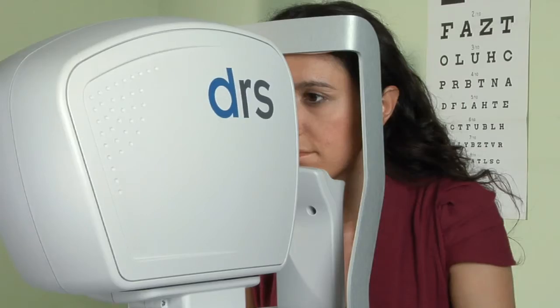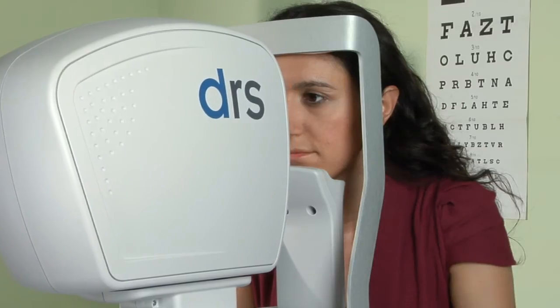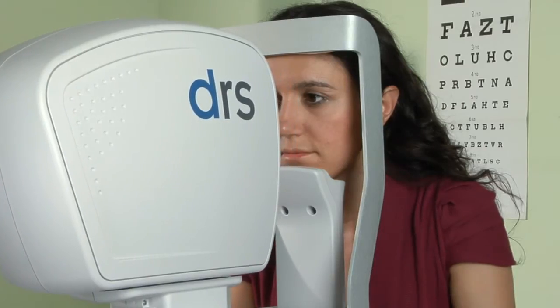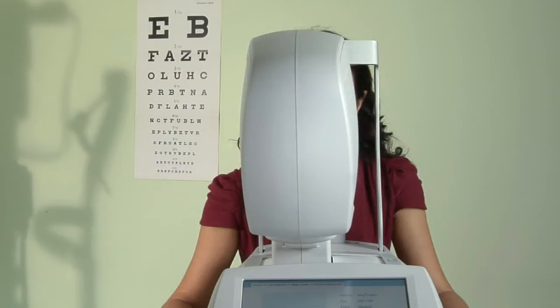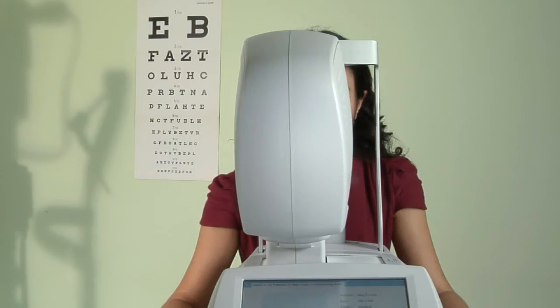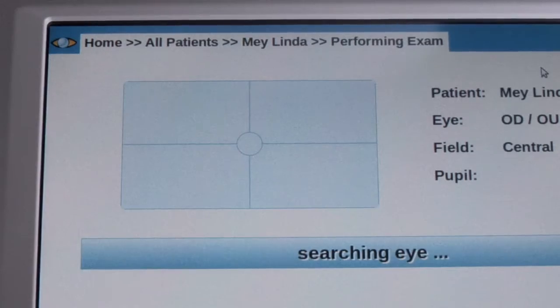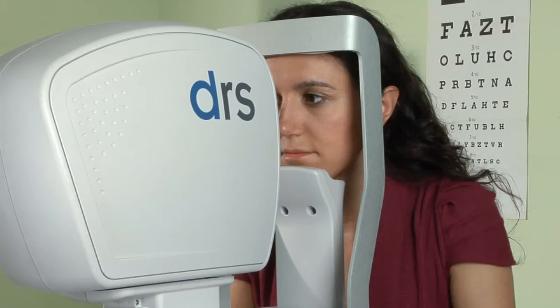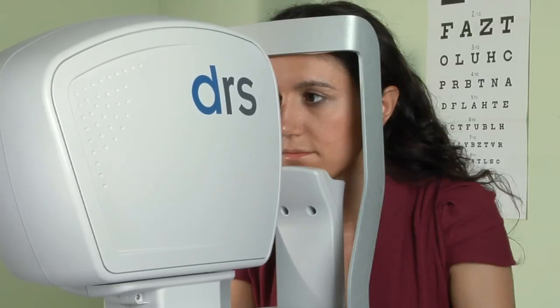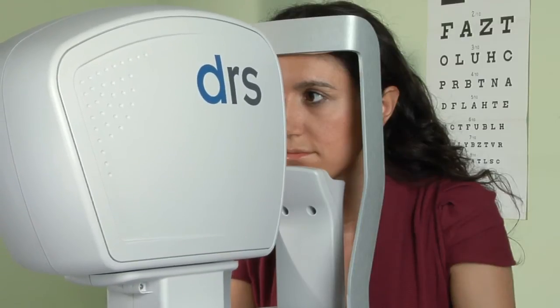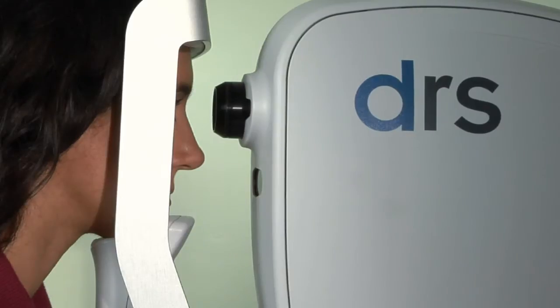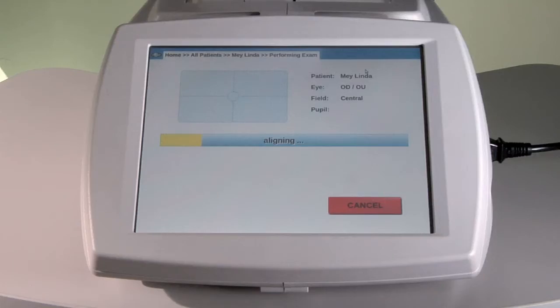From this point on, the process is completely automated. No operator is required as the DRS self-aligns to the eye under exam, automatically focuses and captures the image.